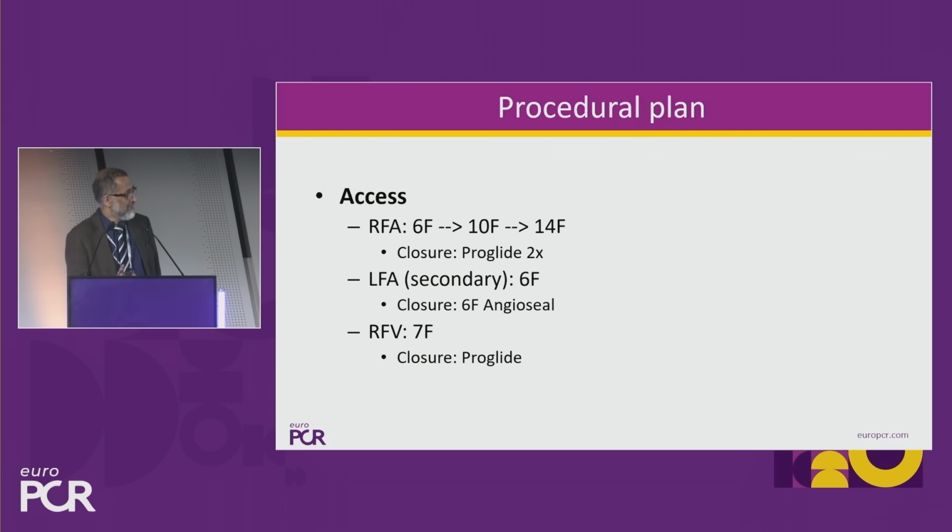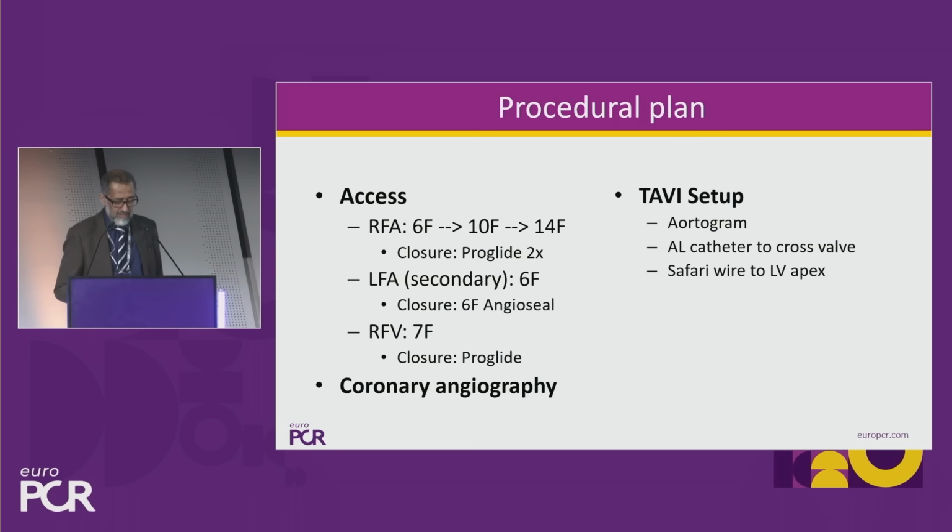And actually, that gives them an access so they're not fiddling about putting central lines in. No urinary catheter, no central line in the neck, no formal temporary pacing wire. But I do 2 accesses, not a single access procedure. The angiogram is going to be done on the day. The aortogram is done with a pigtail in the non-coronary sinus and an AL1 catheter in the left coronary sinus. No pump injections. It's 5 mils into each. We'll show you what you need to see.